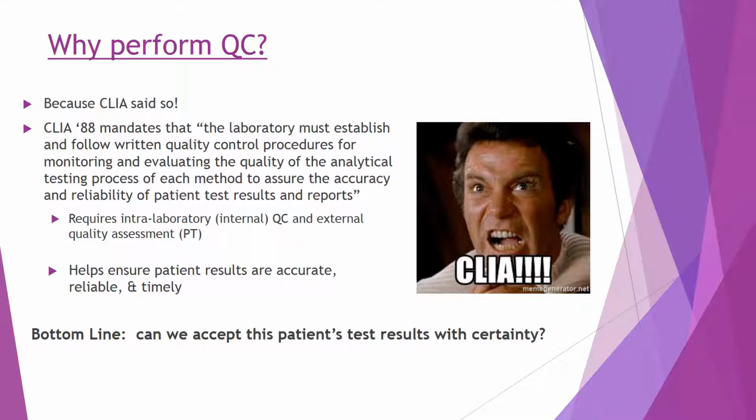And the bottom line for why we perform QC is this. Can we accept this patient's test results with certainty? You should ask yourself this question often, and before you release results, always make sure the answer to that question is yes.